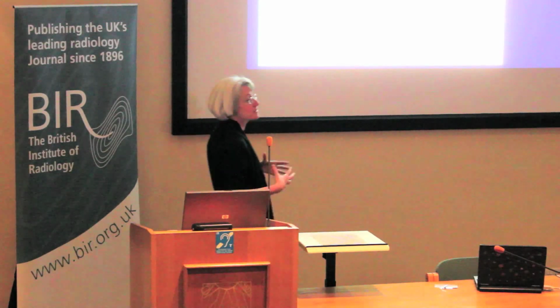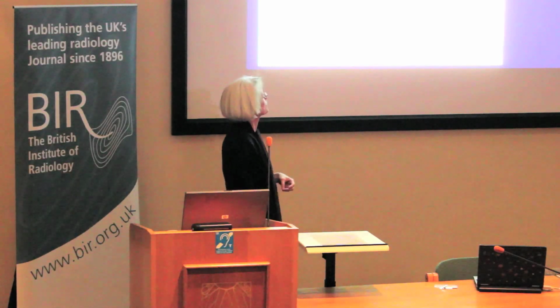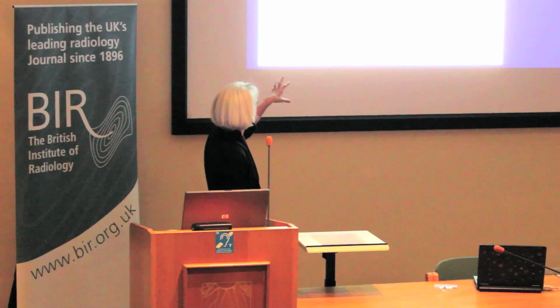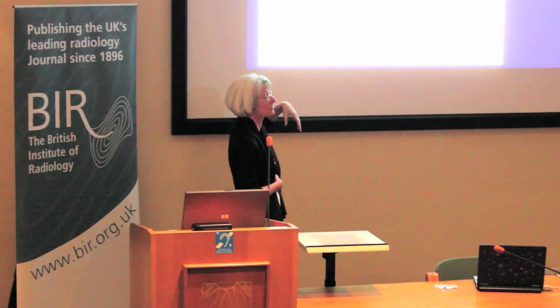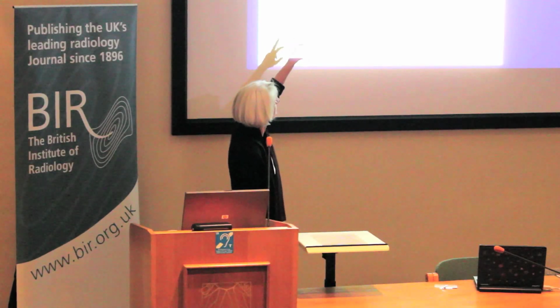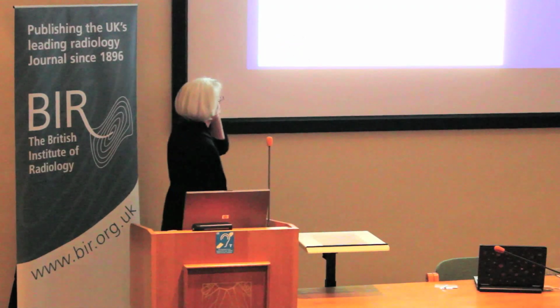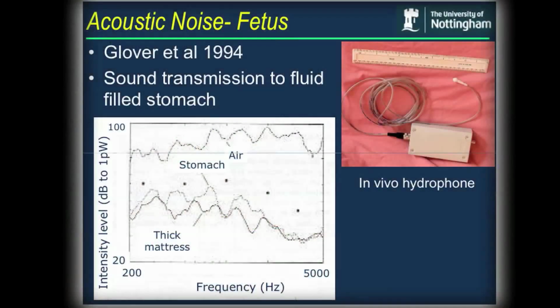Also, of course, the mother's abdomen itself is absorbing, and there's fluid within the abdomen which is absorbing. So we did a study looking at the intensity level of sound within the stomach, a fluid-filled stomach, using a hydrophone, and measured the sound level within the stomach compared to the airborne sound. And if you do that, you find there's probably about 30 decibels of sound attenuation right across the spectrum, which exceeds the effects of the headphones.